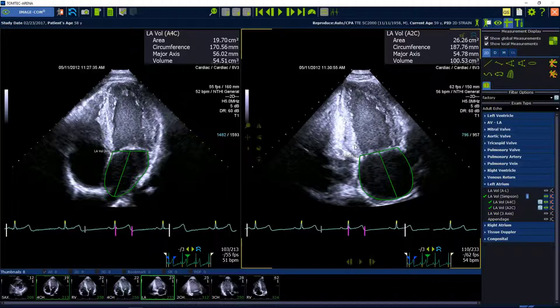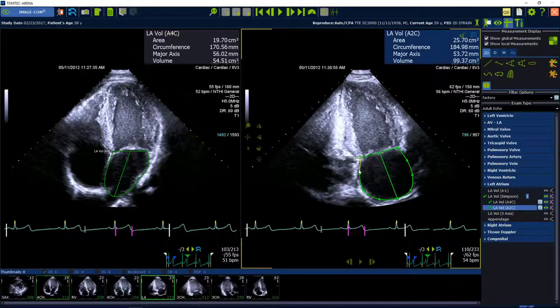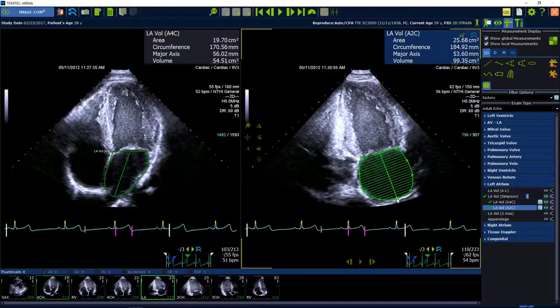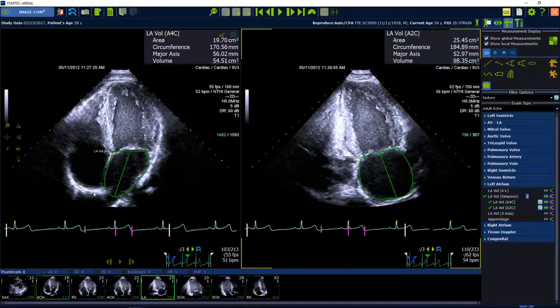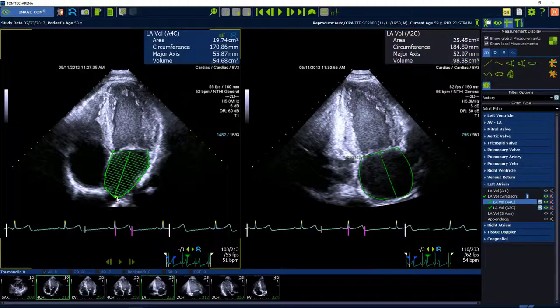The contour can be adjusted in end-systole: you can move the contour via drag and drop and adjust it, you can add single points with a left mouse click, and you can also remove points with a right mouse click.